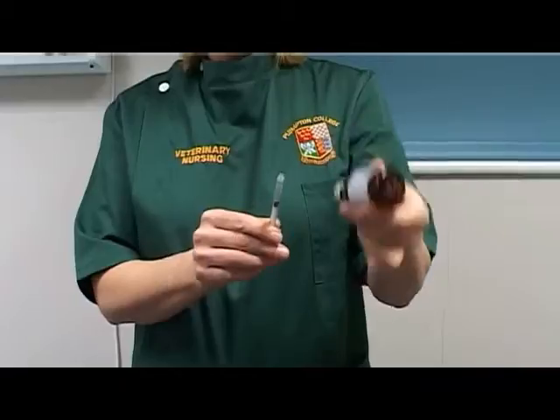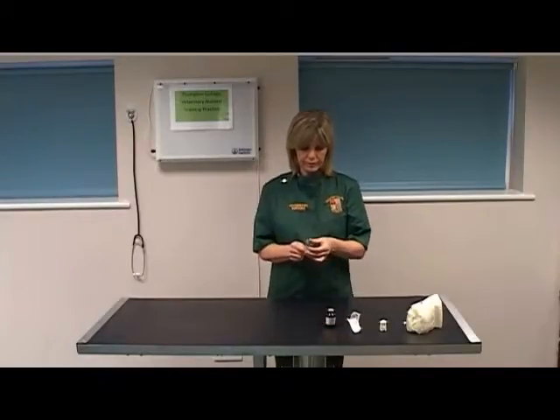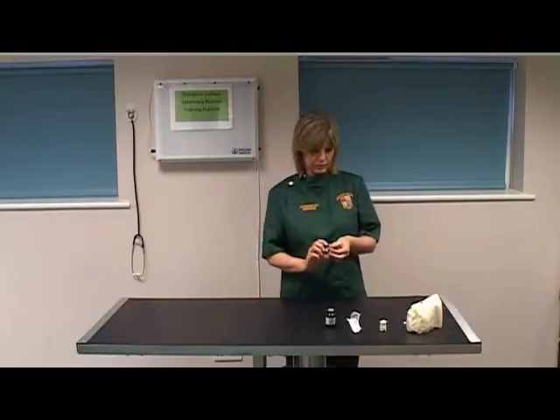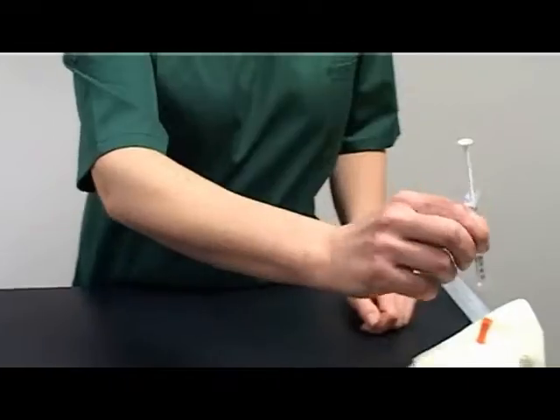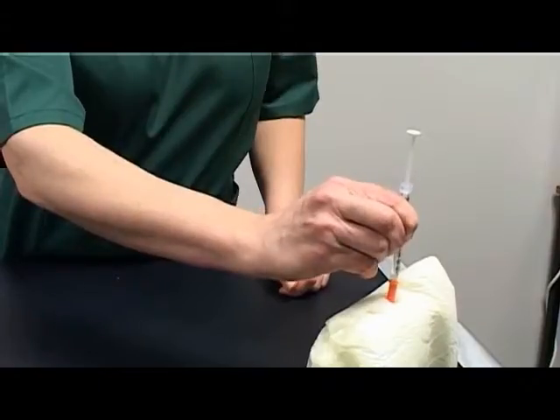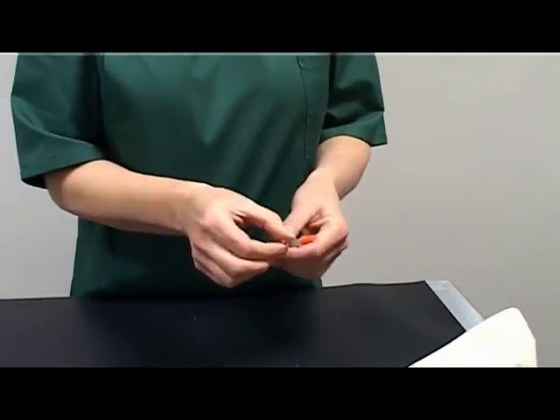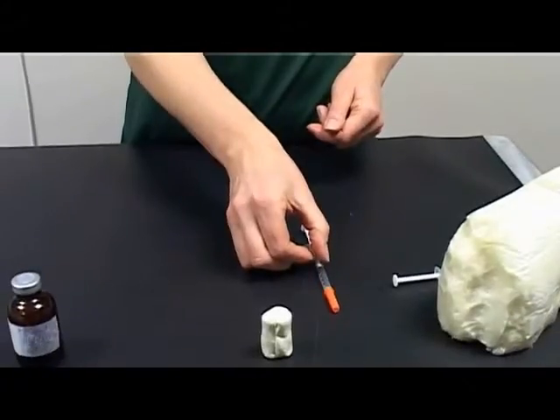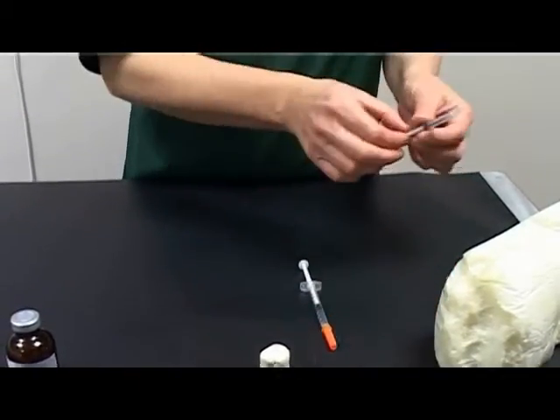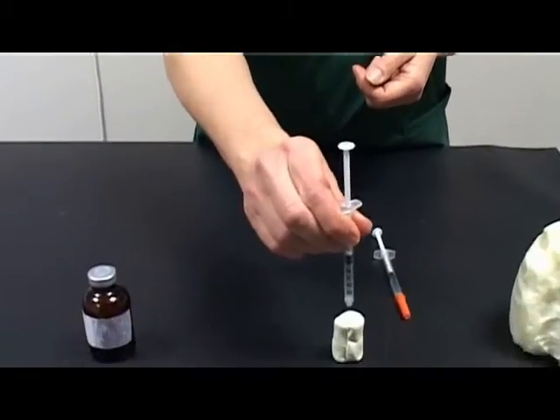Withdraw the needle from the vial. Either resheath using a foam block, or place an unsheathed needle into a plasticine block for the examiner to check.